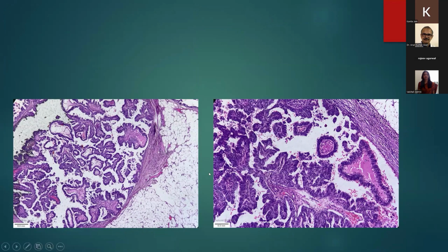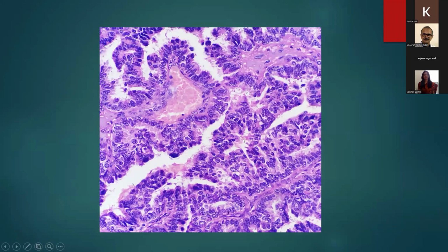So Dr. Tanuja has discussed papillary lesions in detail, but I've just included 2 of the papillary types because these are diagnostically challenging for the pathologist. What are these? One is your classical encapsulated papillary carcinoma. This is a tumor arising in a cystic space. They have a fibrous capsule, and you have a papillary tumor with fibrovascular cores arising within this space. The nuclei are generally perpendicular to the fibrovascular core, mild to moderately pleomorphic.